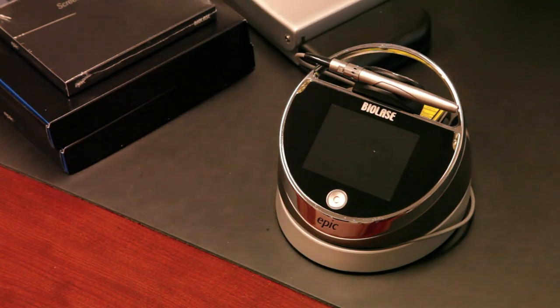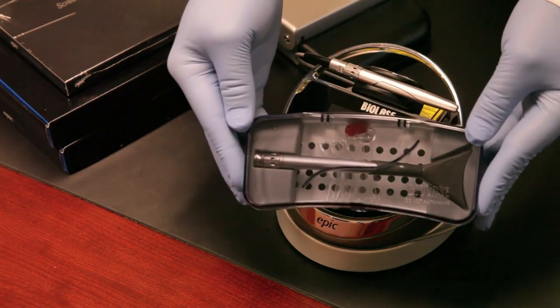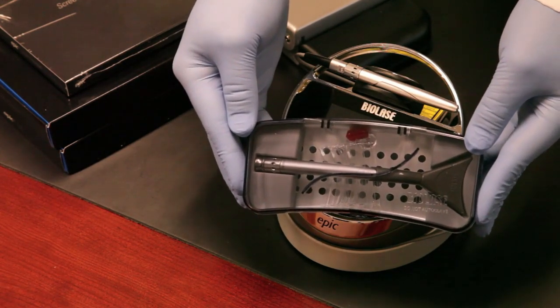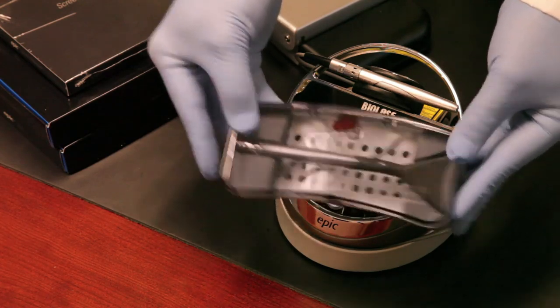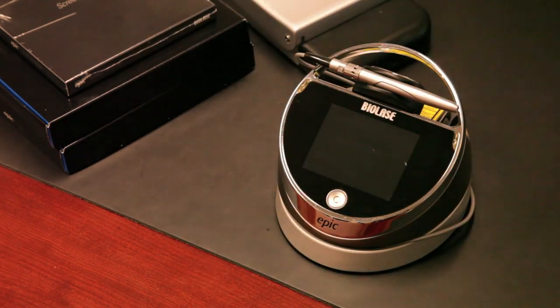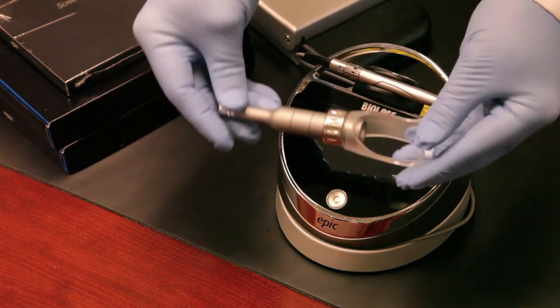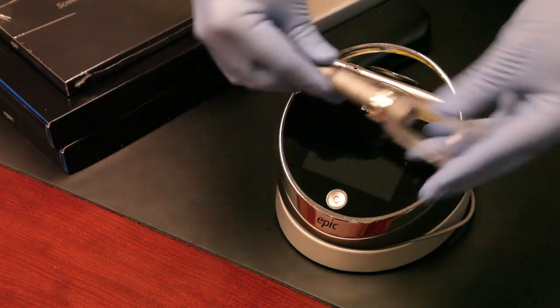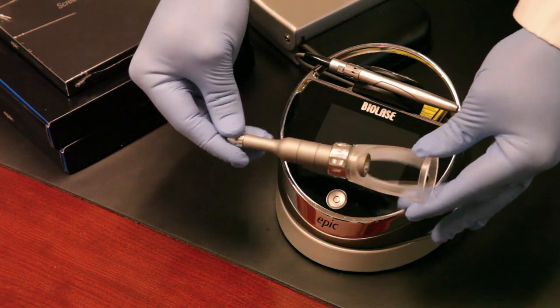If you order our whitening package, you will also receive, in addition to the two handpieces, a whitening handpiece — that's for performing tooth whitening with your EPIC laser. We also offer the opportunity to get a pain therapy package, which includes this deep tissue handpiece, which attaches right here to the end of the laser as well.